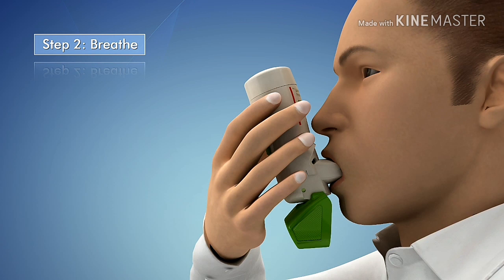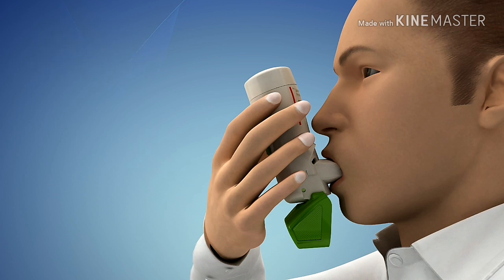The SynchroBreathe inhaler will automatically release a dose when you begin to breathe in from the mouthpiece. Continue to breathe in even after the click sound until the full breath is taken.